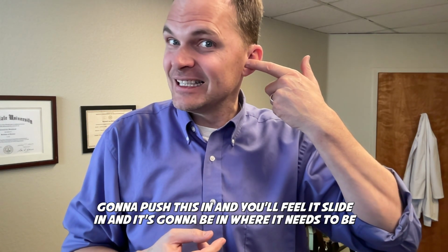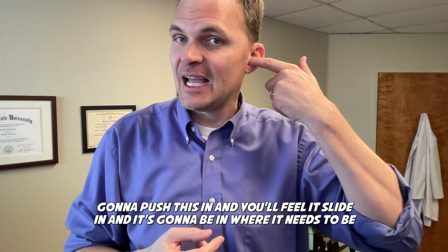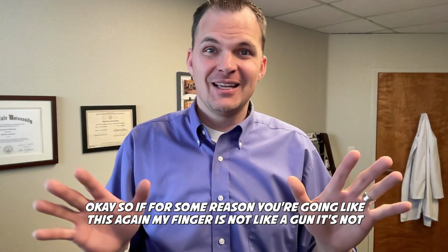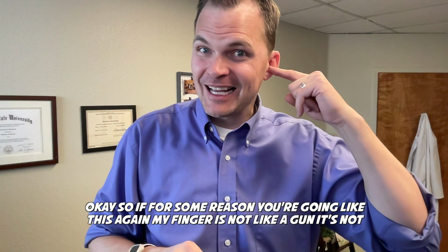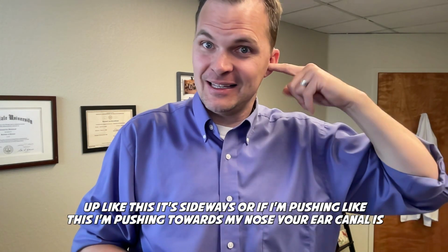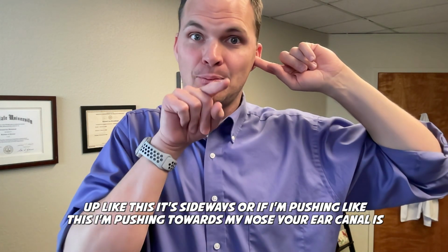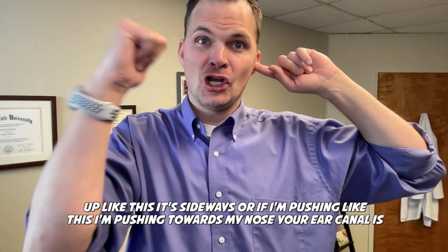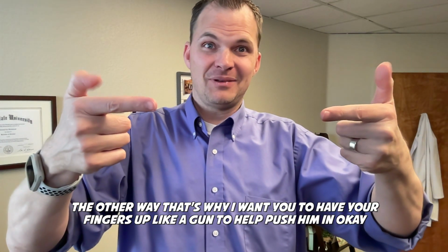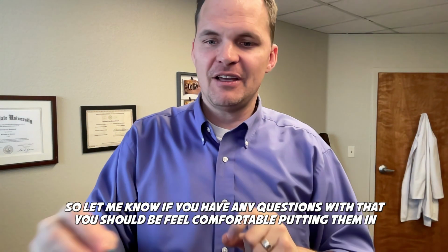I'm going to push this in, and you'll feel it slide in, and it's going to be where it needs to be. So if for some reason you're going like this, again, my finger is not like a gun, not up like this. It's sideways. Or if I'm pushing like this, I'm pushing towards my nose. Your ear canal is the other way. That's why I want you to have your finger up like a gun to help push them in. So let me know if you have any questions with that.